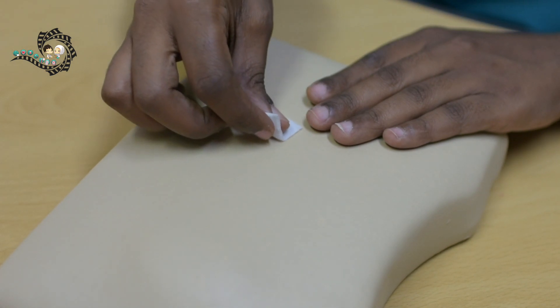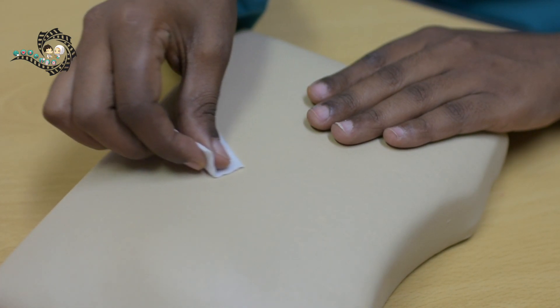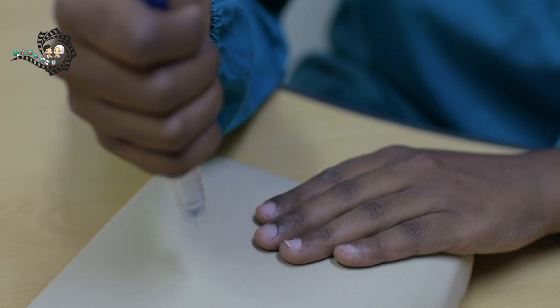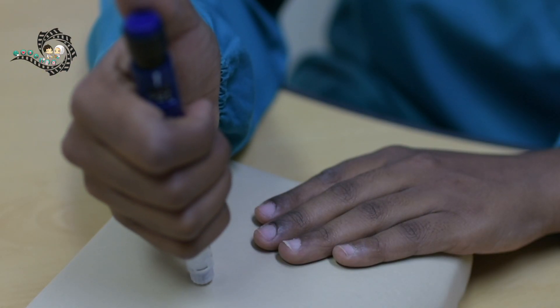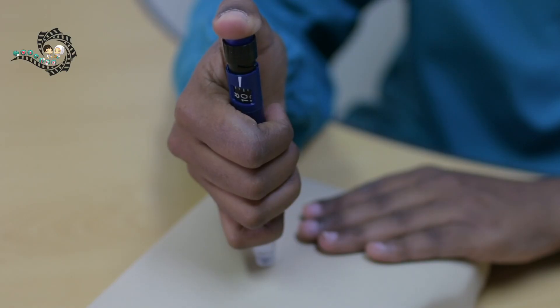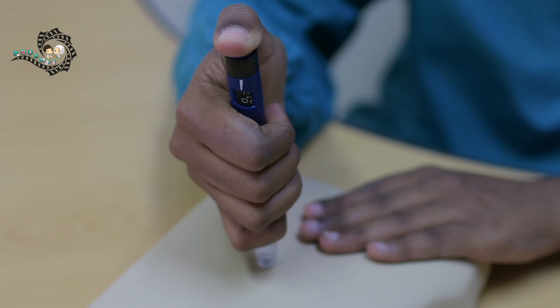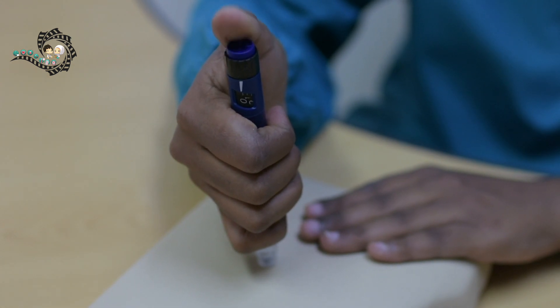Step 6: Once you have selected the injection site, wipe the area with an alcohol swab and make sure to let the area dry completely before giving the injection. Insert the needle into the skin at a 90 degree angle. With your thumb, press the injection button slowly until the full dose is delivered or until the number in the window goes back to zero. Before removing the needle, wait for 10 seconds or count to 10 slowly.